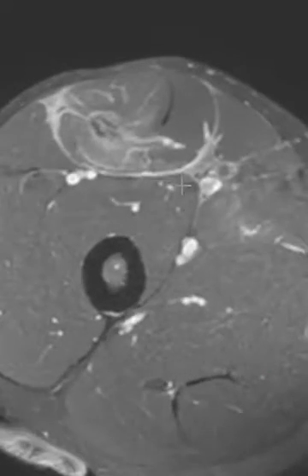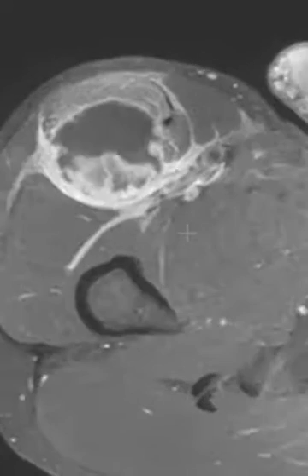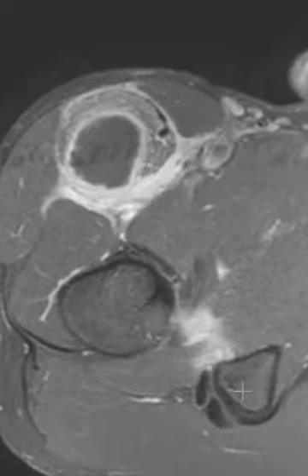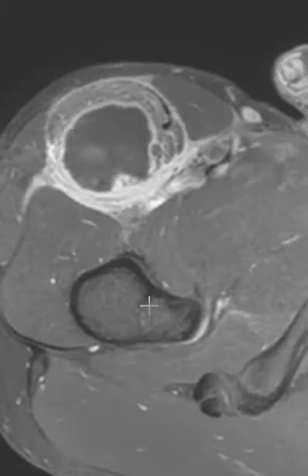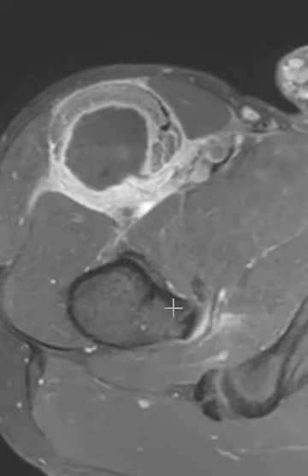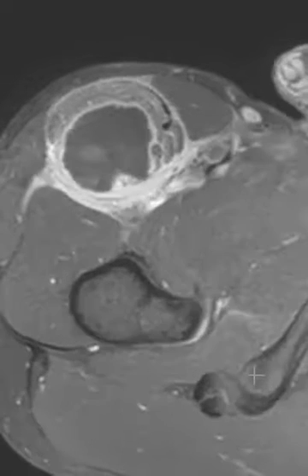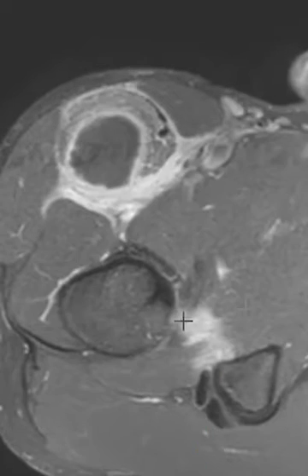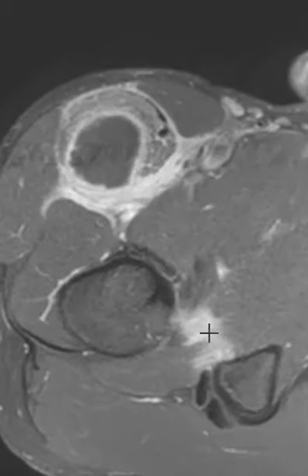This patient also had something else interesting. Going up higher, right in this area here — this is the lesser trochanter, and this is the ischium, and right between them we have the quadratus femoris muscle. There's a high-grade muscle tear right there with some edema or hemorrhage at the site of tear.